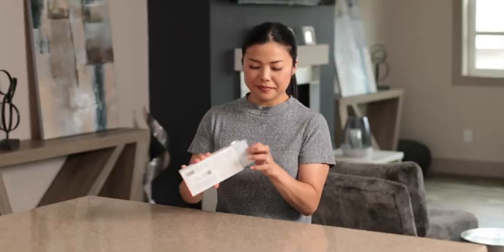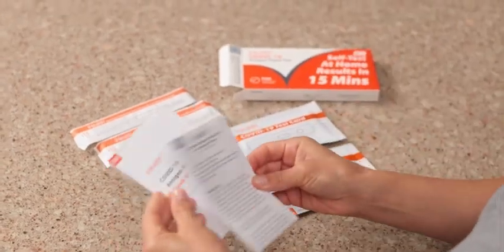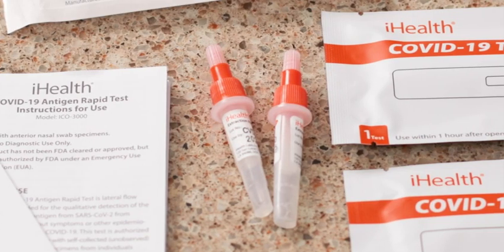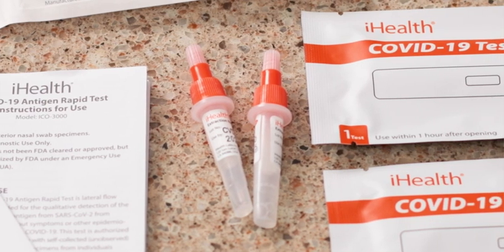Once it's dry, lay out the following items from your kit, but don't remove them from their individual packaging just yet. In the box is a swab, a test card, and a test tube. Your test tube will likely have the testing solution already inside, but in some cases you may have received the solution in a separate packet.